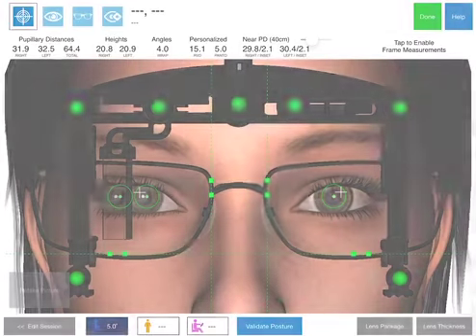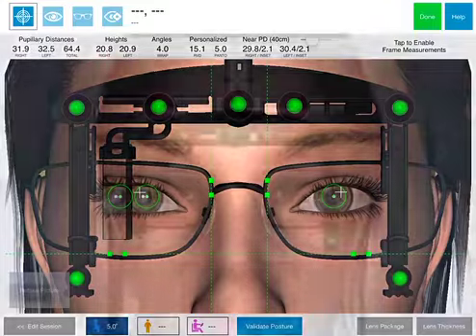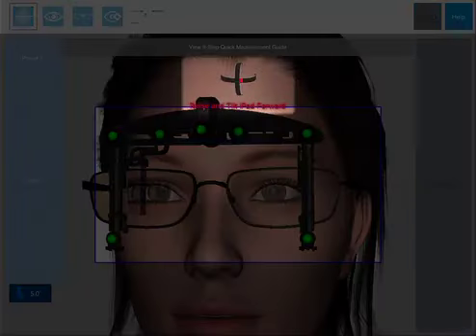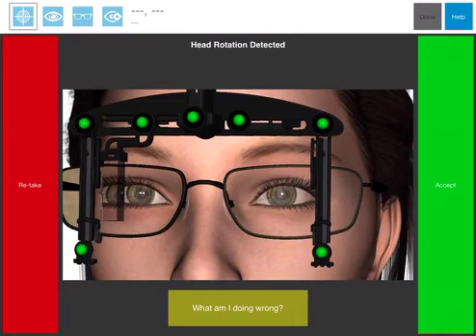Once the measurement image has been taken, the app will verify that the customer's head tilt and head rotation fall within acceptable tolerance zones. Out-of-tolerance parameters will generate an appropriate error message and, in some cases, require that the measurement image be retaken.